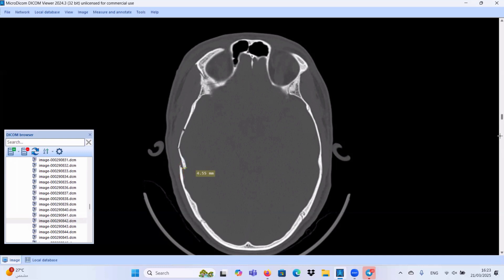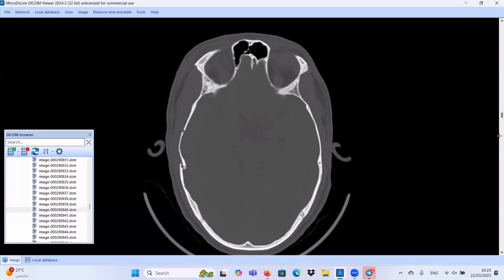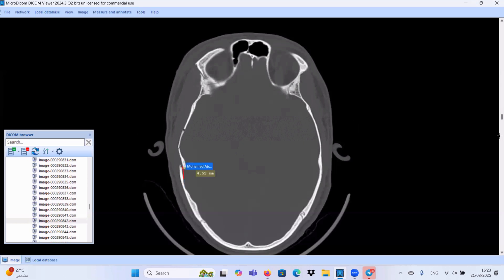And second point, we should measure the depressed fragment from the inner table of the non-depressed bony segment, from here to the inner table of the depressed bony segment. And this one measures about 4.5 millimeter.